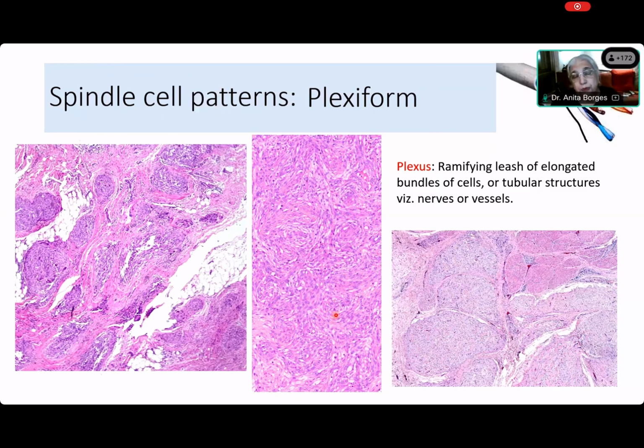But because spindle cells have an elongated structure, they can also be seen as a plexus. So it's a ramifying leash of elongated bundles of cells or tubular structures such as nerves or blood vessels. Very good, Saida. You have been able to do this.